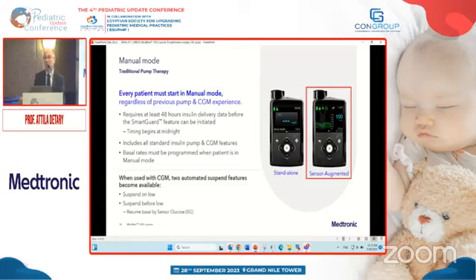And very importantly, the active insulin time. So the active insulin time is the pharmacodynamics of insulin. After a bolus, when the patient eats, and before they eat, the patient delivers insulin, it works in the organism for a couple of hours. And the pump needs to know what is this duration. So we call it an active insulin time. And normally for adolescents and adults, it's around 3-4 hours. For children, it's shorter, 2-3 hours.